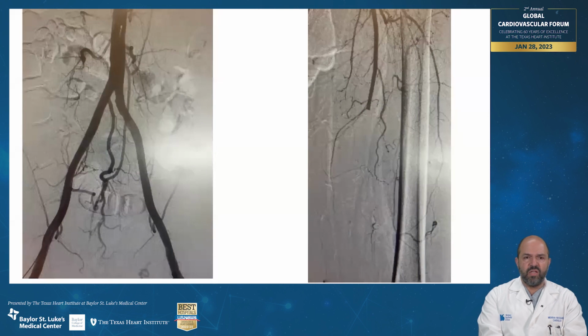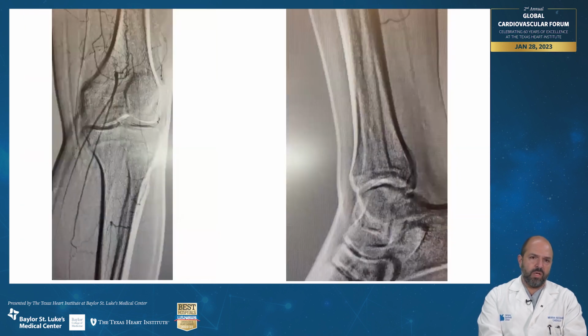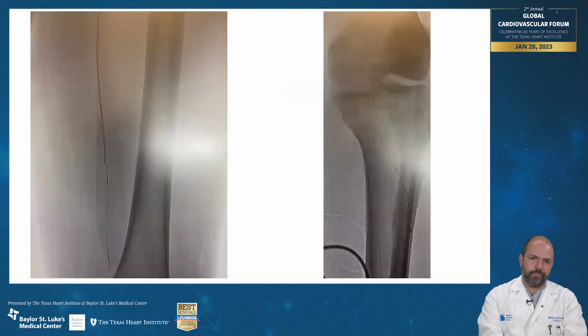First thing we did was an aortogram as we usually do, and then we went up and over to the contralateral leg. We had a right common femoral access, went to the left leg, and you see that there's an abrupt occlusion of the mid-SFA over there. Next pane down, again, no flow going all the way down to the popliteal. We see a small geniculate collateral, likely from a profunda, and his tibial runoff was very, very poor. Had a scant distal dorsalis pedis, and that was really just about it.